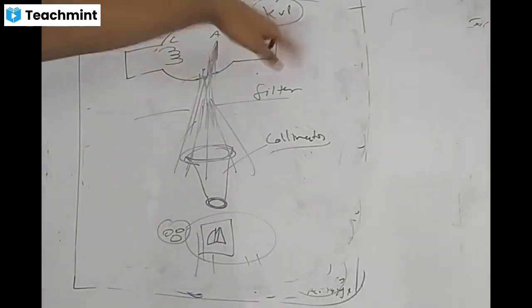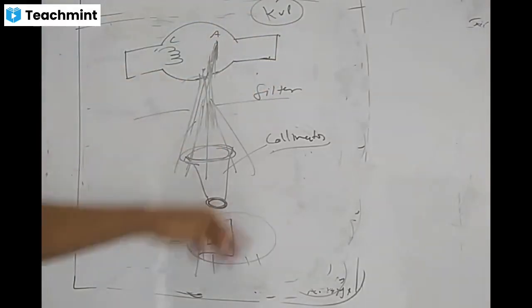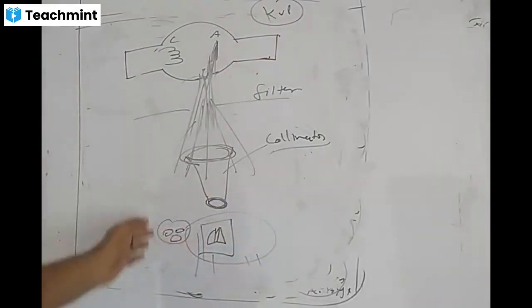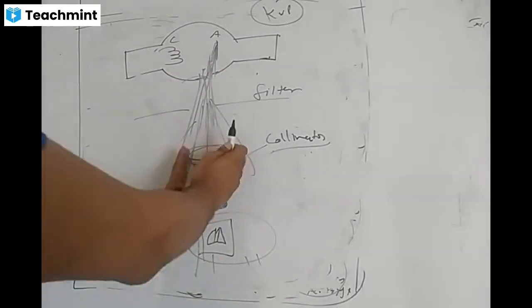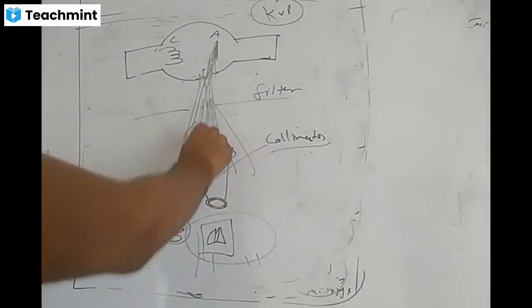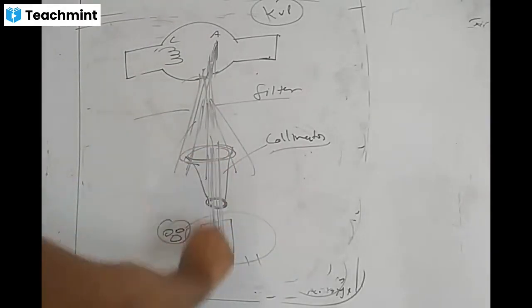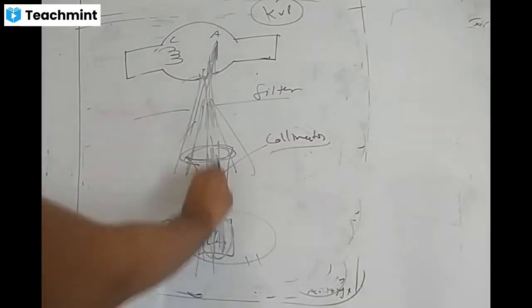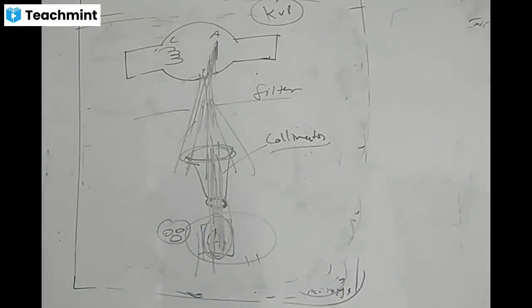So the filter removed all the low energy soft X-rays. Then the beam was divergent, giving unnecessary exposure to the pelvic, abdominal and head areas. We want to examine only the thoracic part, so the collimator makes the divergent beam directional. Only this portion will get the X-rays, and you can examine your desired target, the lungs. So this is the role of the collimator, to make the divergent beam directional, and the role of the filter is to filter out the low energy X-rays.